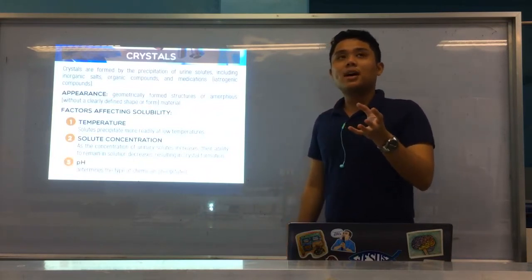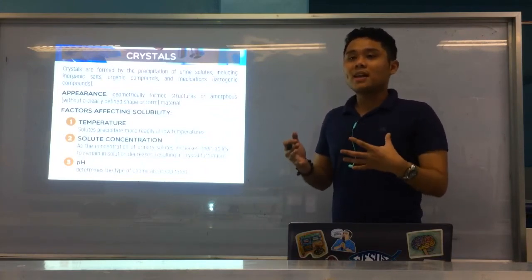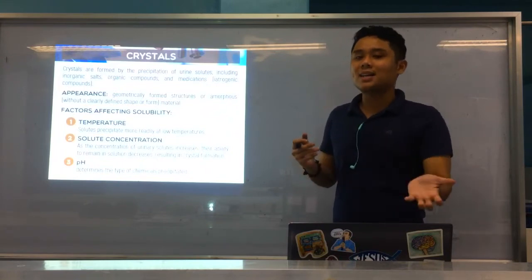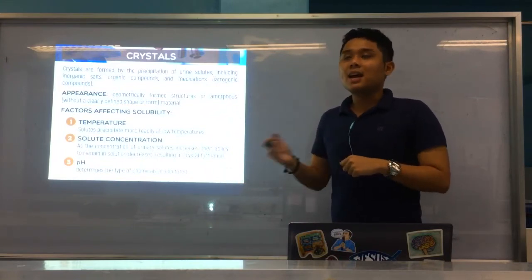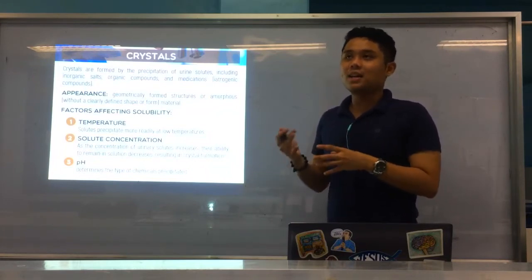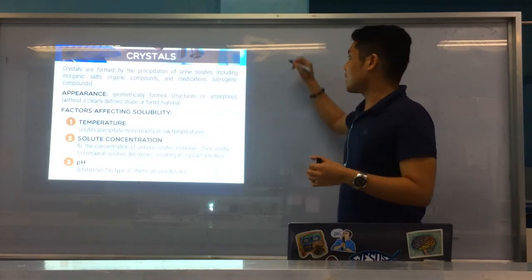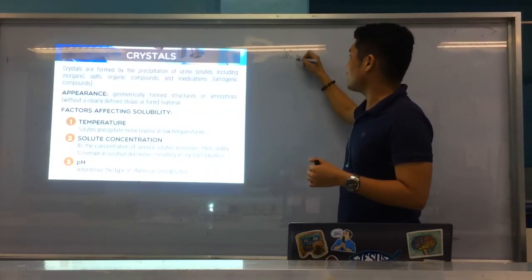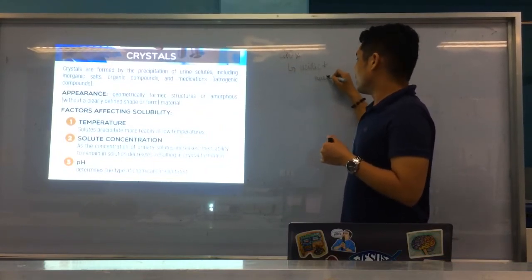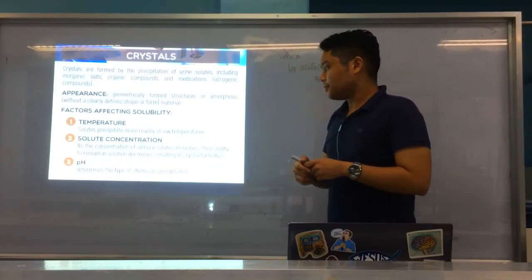Aside from classifying crystals into normal and abnormal, we also classify them based on the pH of urine where they are found. There are crystals found in acidic urine and those found in alkaline urine. Now, most of your abnormal crystals usually precipitate in acidic urine. Okay? Acidic urine. Except for one normal crystal, CaOx or calcium oxalate, which is found in both acidic and neutral urine. Okay? Calcium oxalate. Alright?